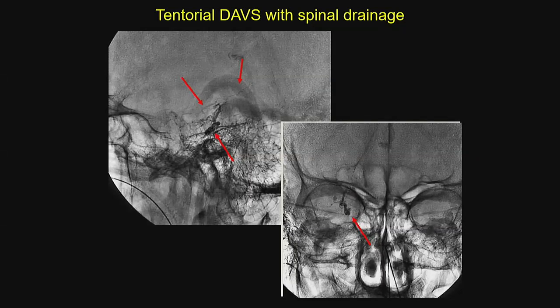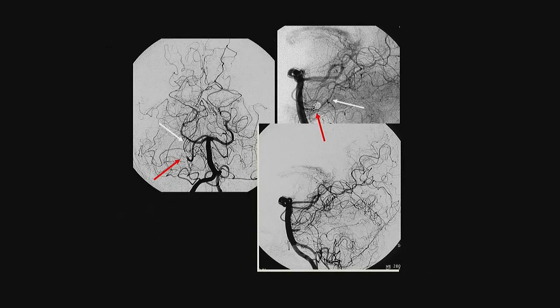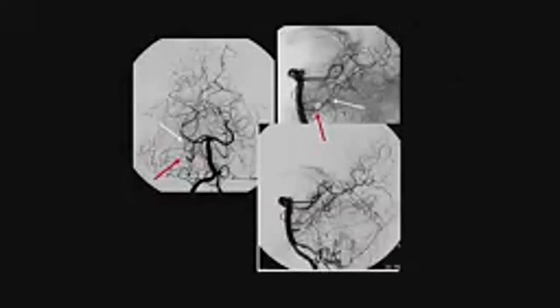So finally, we got the cast here with the vein. So we disconnected the artery from the vein. This is how it looks, and this is the final result. And you can then address your aneurysm, and that's what we did. We pulled back and then went with the other catheter and placed some coils and closed the aneurysm.